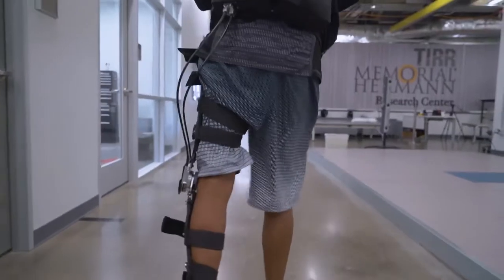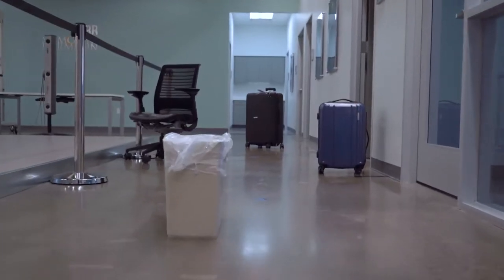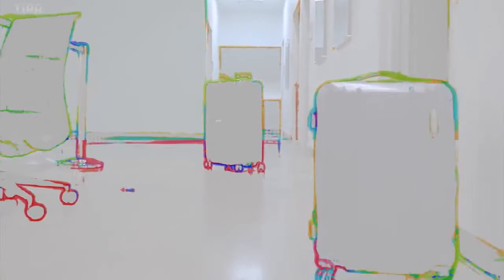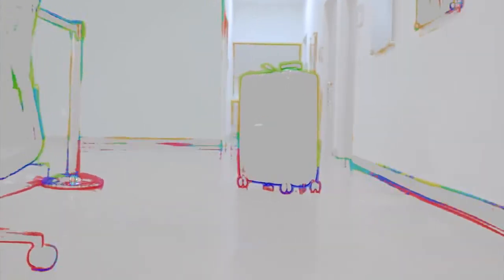This robot has a camera that will give feedback to the user so that the user will be able to correct their position and avoid hitting something, or maybe even avoid falling.